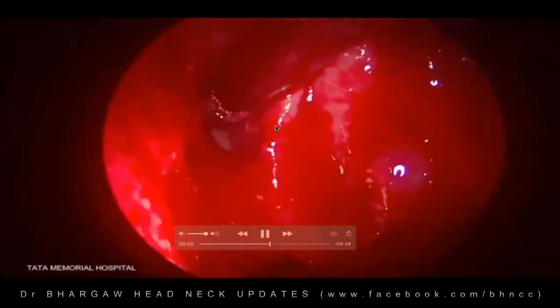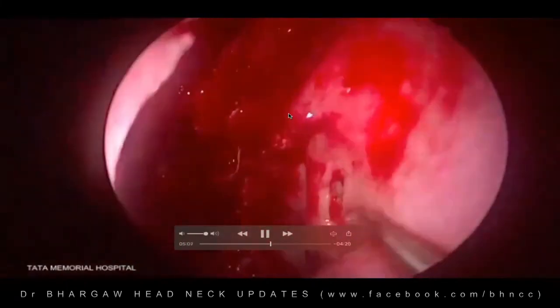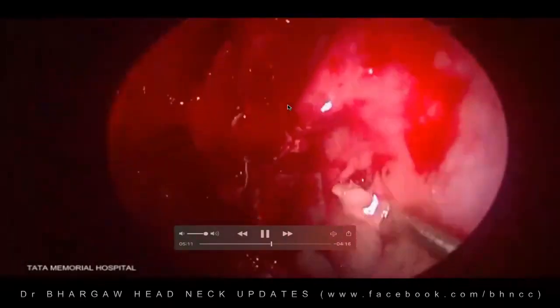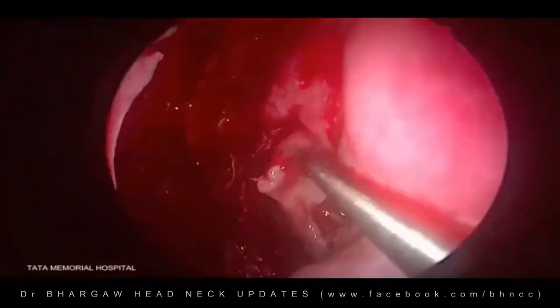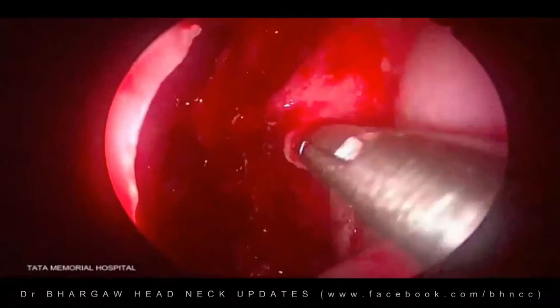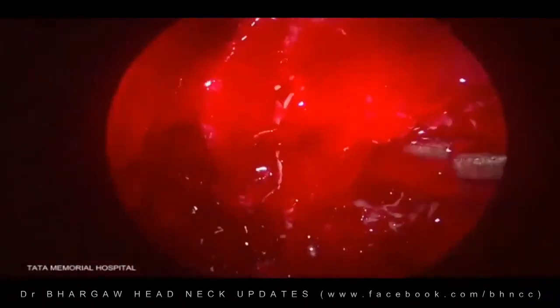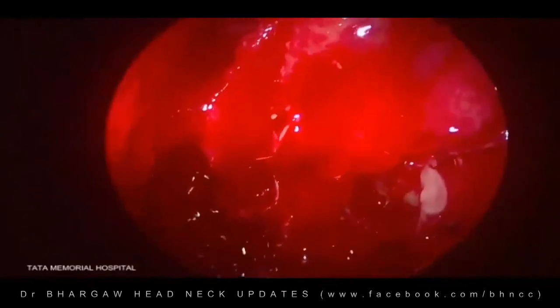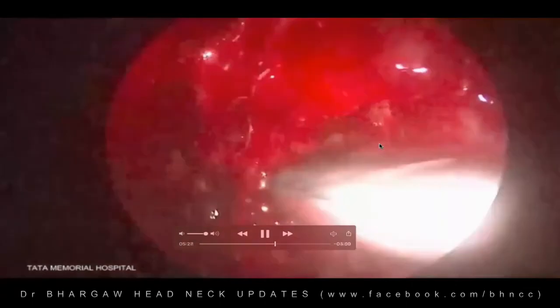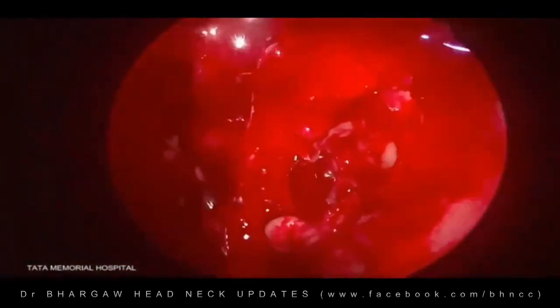Posteriorly, you will see the ethmoidal artery. Now I'm just doing an uncinectomy on the opposite side, that is on the left side. We now did the uncinectomy, ethmoidectomy, and the sphenoid opening on the right side, and are doing the similar procedure on the left side now. And in the process, the tumor was debulked. Here we're doing an ethmoidectomy, and then we'll be opening up the sphenoid, and then the antrostomy would be done.